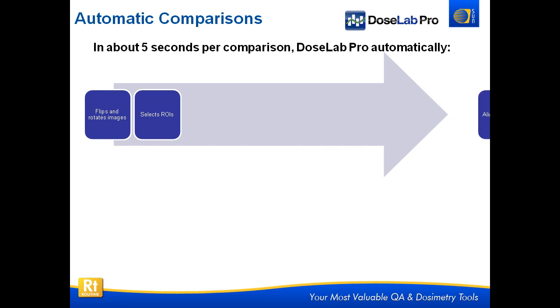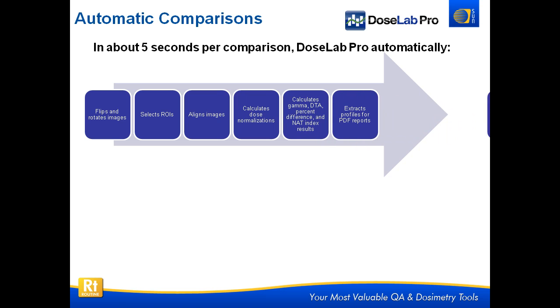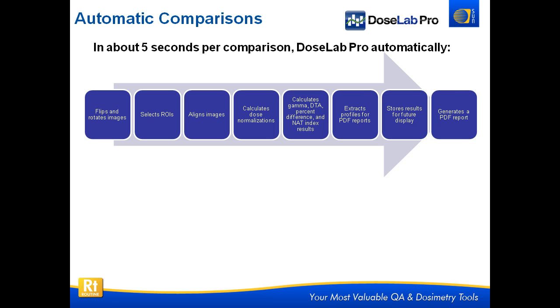Automatic comparisons are also very popular. We've taken the original DoseLab dose comparison interface developed almost 10 years ago and made all these steps happen automatically. When you start an automatic comparison, DoseLab will flip and rotate the images, select your ROI, align the two images and compare them to any fiducials you have, calculates the dose normalization, gamma, DTA, percent difference, and NAT index, extracts profiles for PDF reports, stores the results for future display or analysis in PQI analytics, and generates a PDF report — all of this in about five seconds.